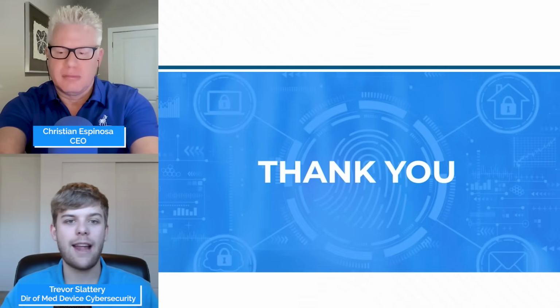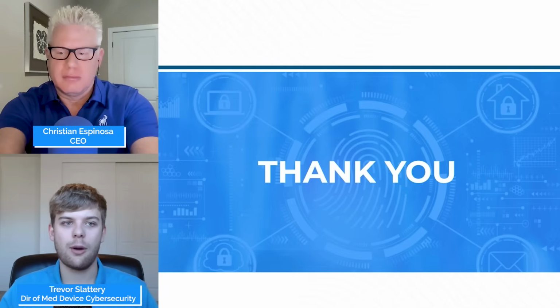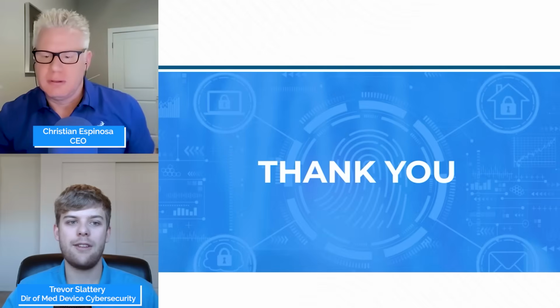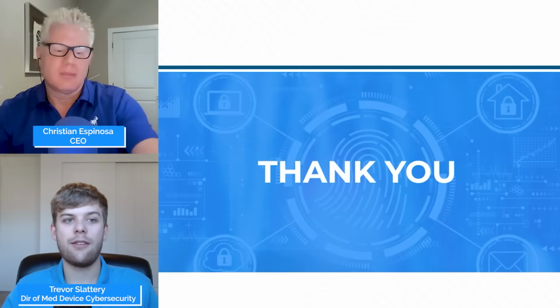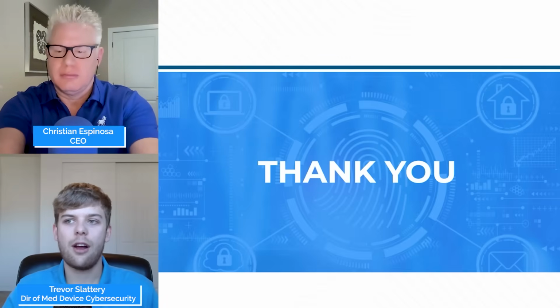We also need to do static testing as a requirement. Static testing is analysis of the code base by automated tooling to look for potential flaws. We need to do SBOM analysis. So SBOM analysis, the software bill of materials, is running over all of the third-party components used in the source code to see if there are any vulnerabilities there. And then another area that the FDA calls out as very important for the security testing side of things is software or security requirement testing.